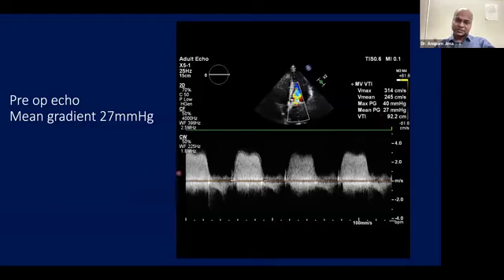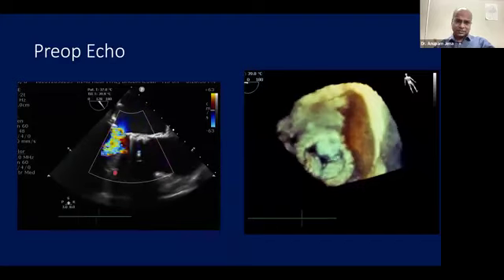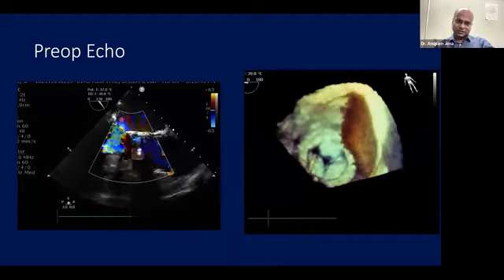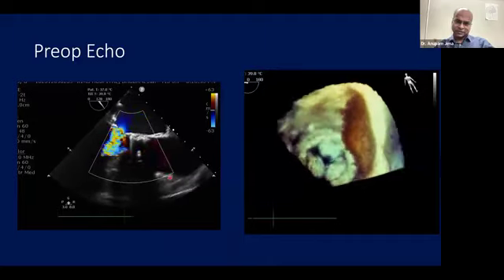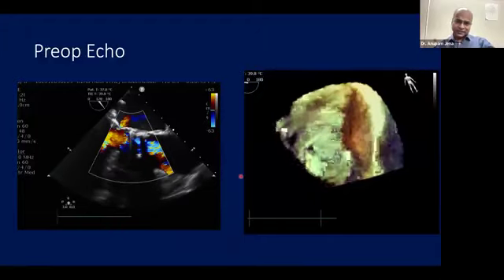So he had basically resting pulmonary edema, and post DVR, around 70 years, there was underlying CKD. Creatinine was around 2. This is the transesophageal echo, showing severe restriction of the leaflet movements. Leaflets are degenerated, and the 3D is showing rare opening of the leaflets.